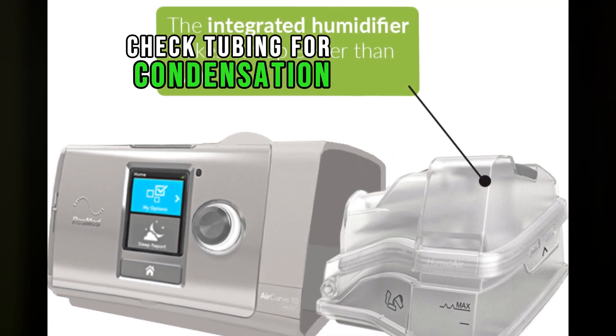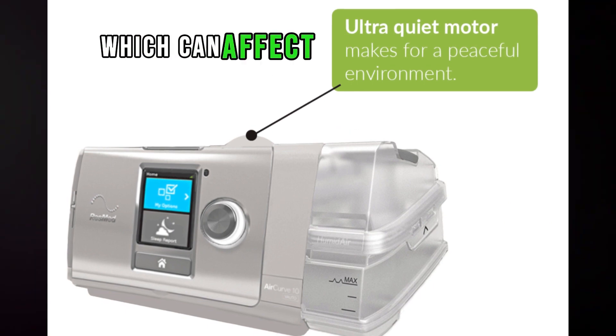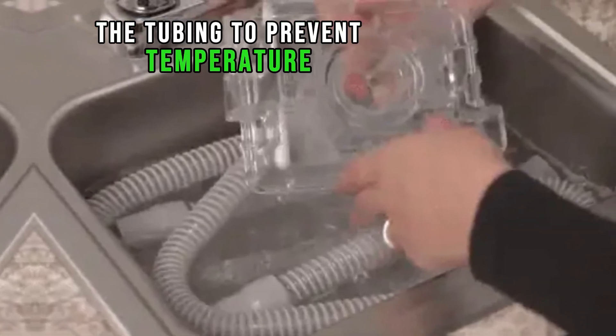Check tubing for condensation. Ensure that there is no excessive condensation in the tubing, which can affect the airflow. If condensation is present, consider using heated tubing or insulating the tubing to prevent temperature variations.